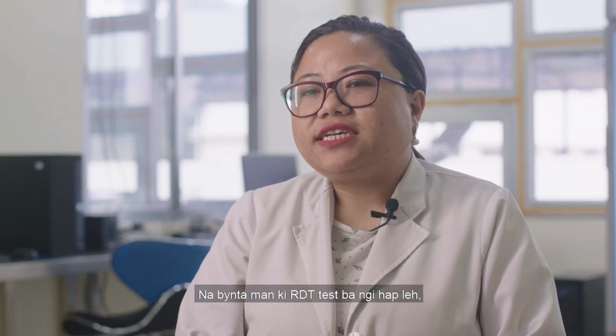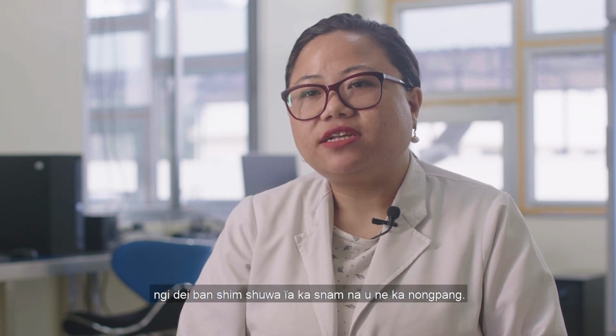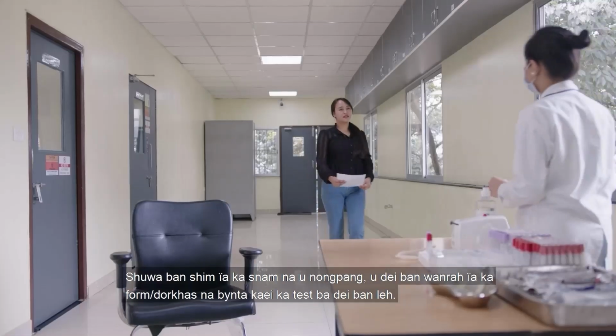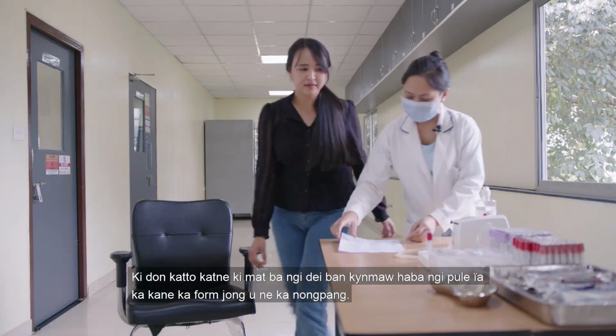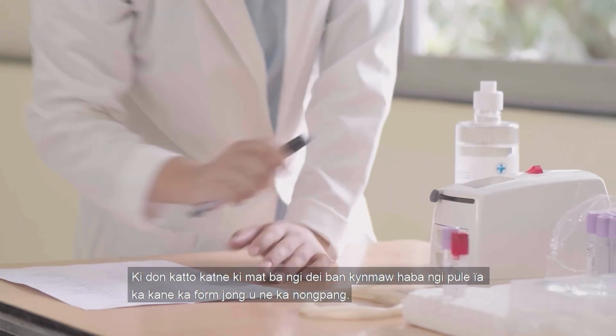For every RDT test that we are going to perform, blood will have to be collected first from the patient. Before collecting blood from the patient, a patient will come with a requisition form for whatever test needs to be done. The first step that you need to follow is to go through the patient's requisition form that will be coming along with the patient.